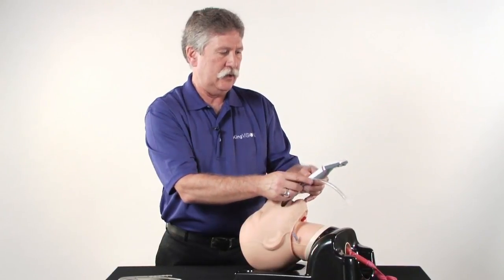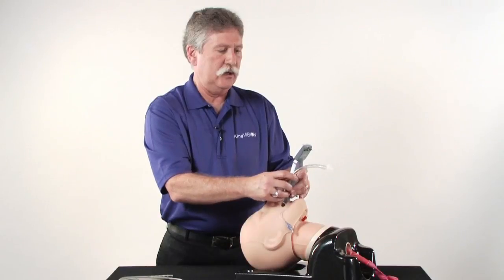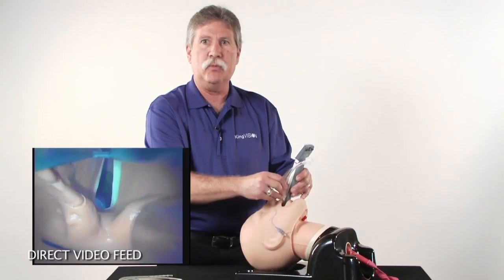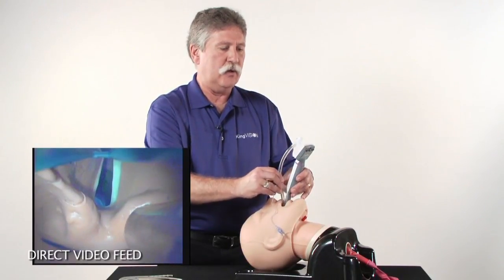If you want to capture a long, floppy epiglottis, you can get a little fine control by manipulating the tube to center it going through the vocal cords. The closer you get to the vocal cords, the more likely you are to run into the right border or the right arytenoid. If that's the case, you'll have to retract the tube, twist it further to the left to advance it into the laryngeal vestibule, and then rotate it back to the normal position to advance it into the trachea.